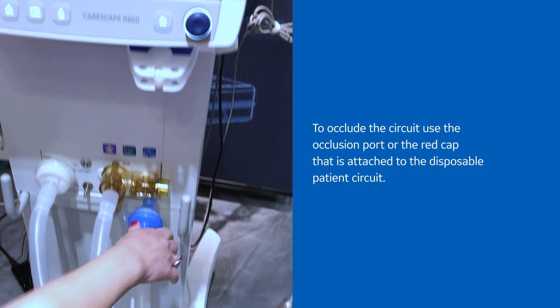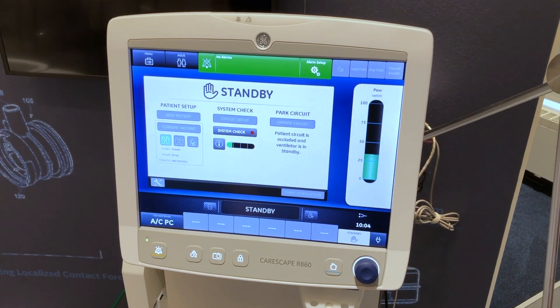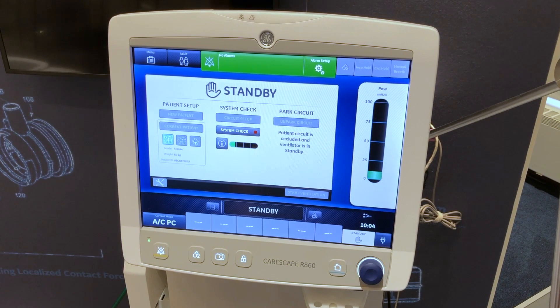Select start. When performing the resistance check, the Y piece and the breathing accessories should remain on the occlusion port.